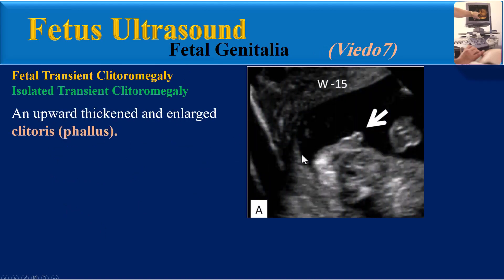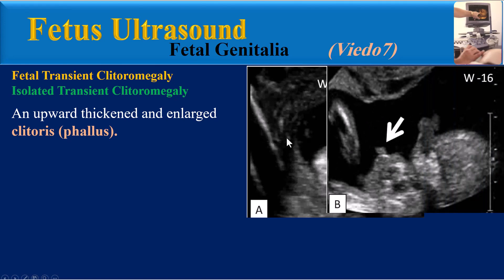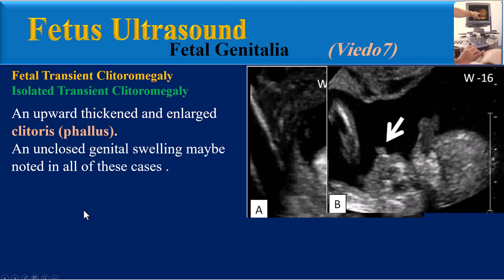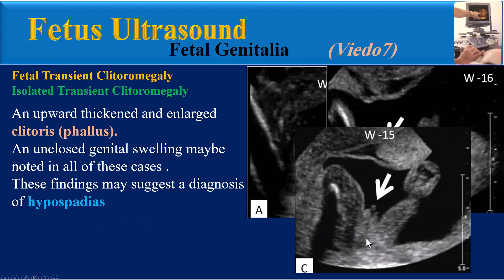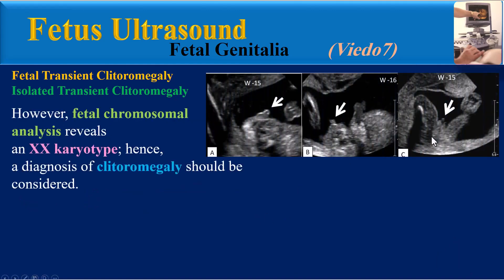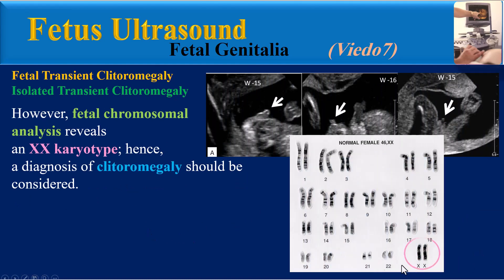Regarding isolated transient clitoromegaly, the definition of clitoromegaly is an upward, thickened, and enlarged clitoris. We can see clitoromegaly at 15 and 16 weeks gestation in this fetus. In a sagittal plane, the clitoris is thick and in an upward direction. An unclosed genital swelling may be noted in all of these cases, and these findings may suggest a diagnosis of hypospadias. This coronal plane from the same fetus at 15 weeks shows male genitalia with hypospadias.